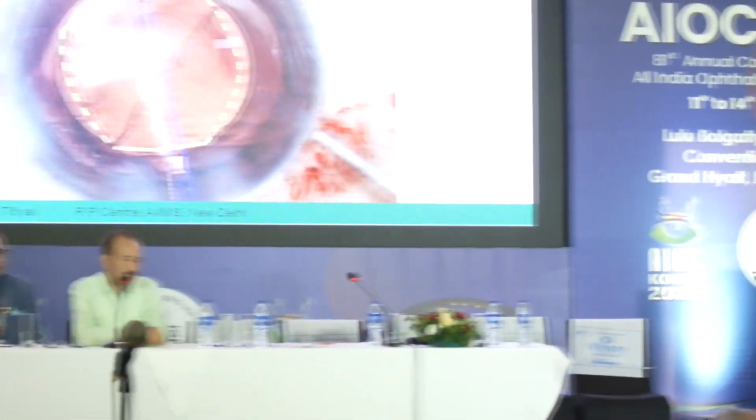It's a stable lens. Any comment on what will happen to the post-op refractive error in this patient, Dr. Rajendra Prasad? See, because now you have done the reverse optic capture, first of all, we have to see the centering. Since it's a trifocal IOL, the centering is very, very important. And then the lens is going to be positioned a little anteriorly, so you are going to have overcorrection. You have to be ready for that. But in a trifocal IOL, a little bit of overcorrection is always better, because the patient will have better near vision. May have a little compromise of the distance vision, but he'll definitely have better near vision.